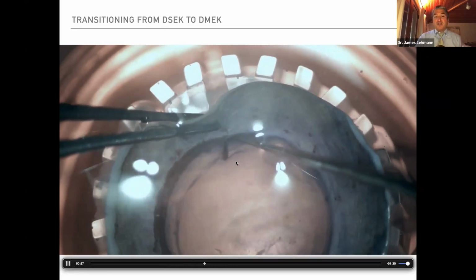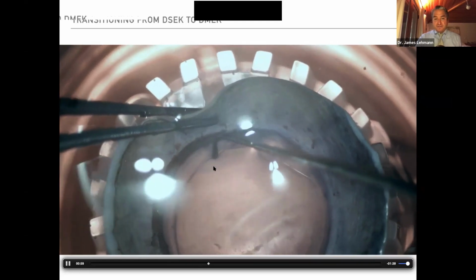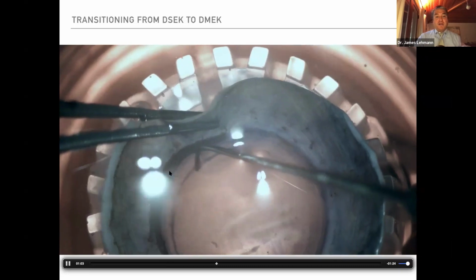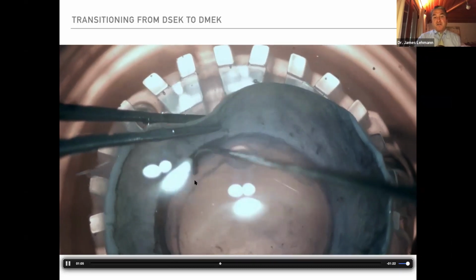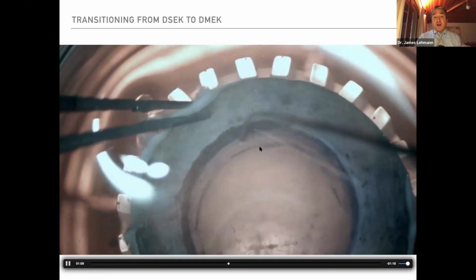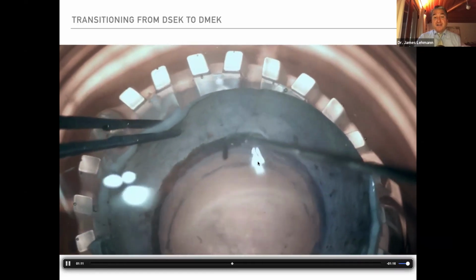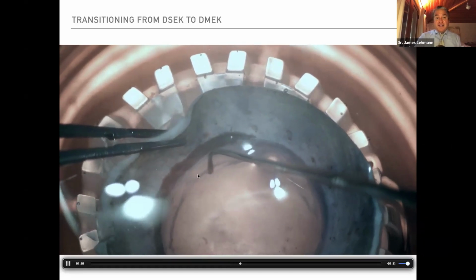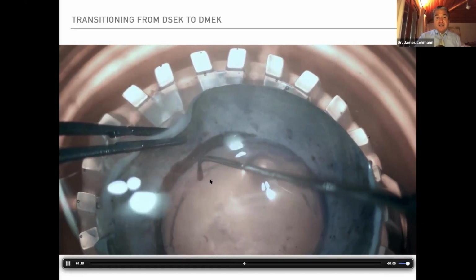And what you're doing is you're starting to lift that edge. This is the most tedious part, but also the most fun, actually, because what you're trying to do is get that edge lifted without causing a tear. And you have to go 360 degrees around. You can't skip any areas here. And the idea is to get an edge lifted all the way around.